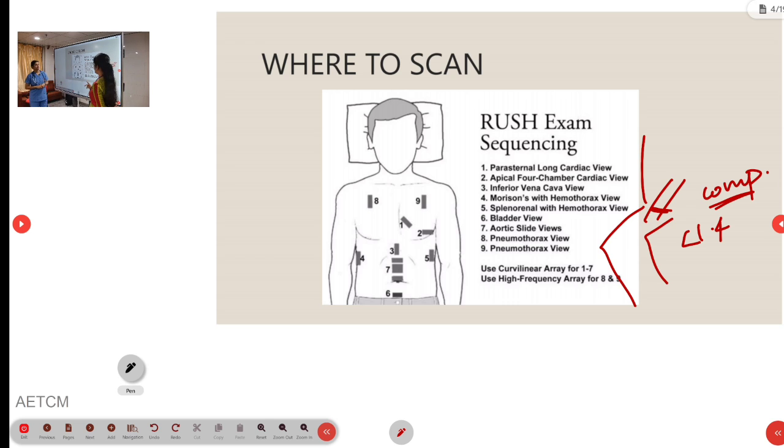Okay. So that is all about RUSH, right? We have discussed the heart, hemodynamics, IVC, Morrison's pouch, aorta, pneumothorax or pulmonary, and then ectopic pregnancy and DVT. Okay. Anything else? Nothing. Okay.